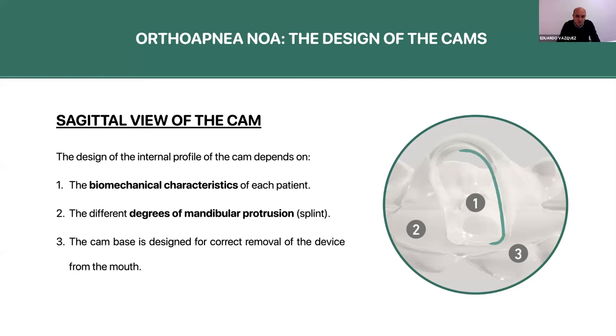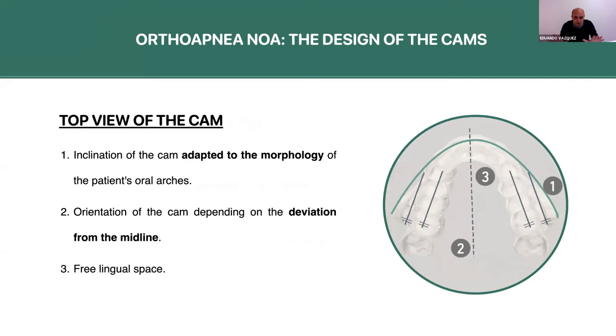If we see also the cam from a top view, you will see that the inclination of the cam can be adapted to the morphology of the patient's oral arches. And for example, if you feel that there is a deviation of the midline of the dental arches, you can also request a change in the orientation of the cam.